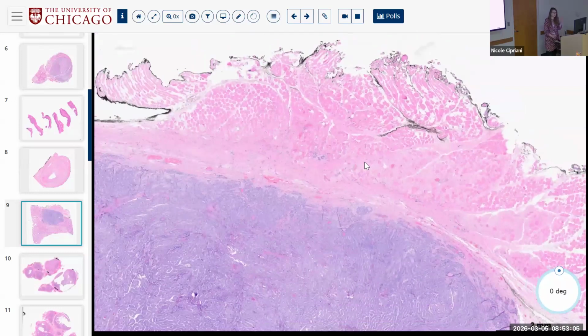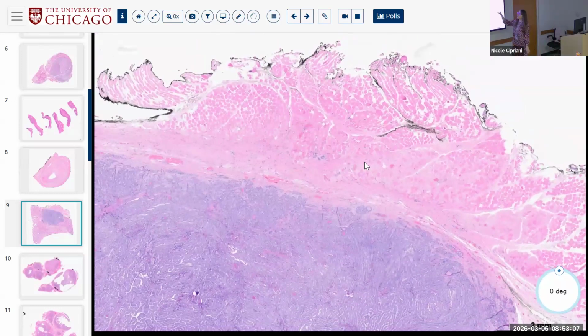But yes, so now, when they take this much skeletal muscle, something clinically is wrong. You see microscopic PTC in the skeletal muscle, you can pretty much assume that it's clinical or macroscopic ETE because they thought something was wrong, you confirmed something was wrong, so now you upstage the patient. So now they get, if they don't already have it, completion with RAI. Normally, if they're taking this much skeletal muscle, probably they're already concerned for something aggressive, so they'll probably have taken the other lobe. Probably, but not always.